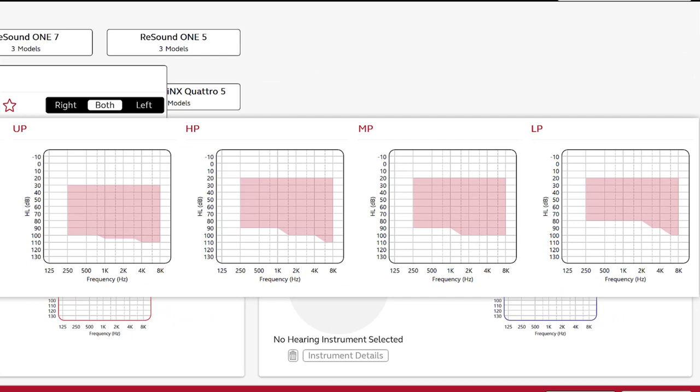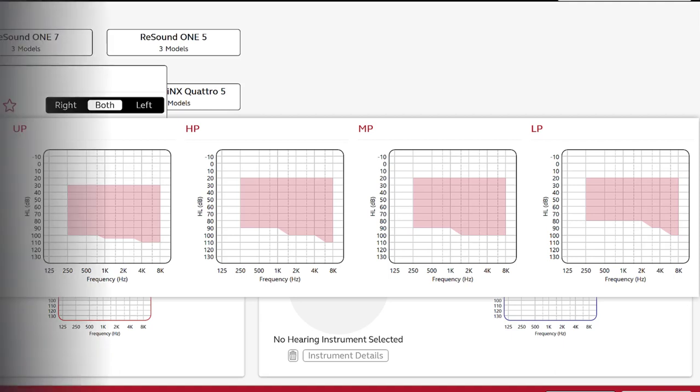You also have a standard receiver option that comes in low power, medium power, high power, and even ultra power, if for whatever reason the MARIE receiver does not work for you or your hearing loss is too severe. So why would you even want to place a microphone on the back of a receiver inside of your ear canal? The answer is the pinna effect.